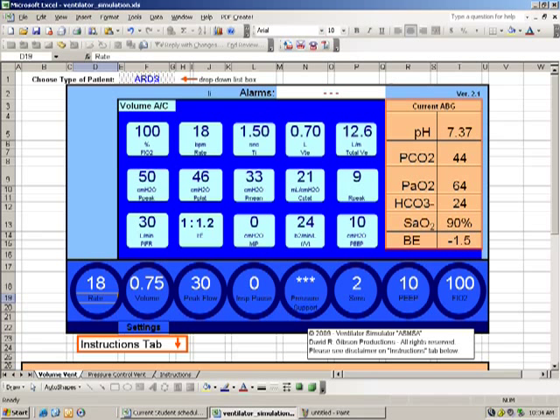But I brought up one major issue. Well, first thing is we have an IE ratio that's less than 1 to 2, and we need to fix that. As you can see, we turned our peak flow up to 60 and have greater than a 1 to 2, 1 to 3.4. That gives the patient plenty of time to expire.